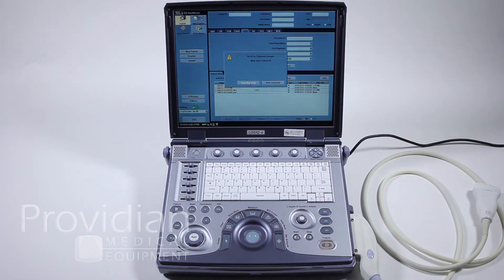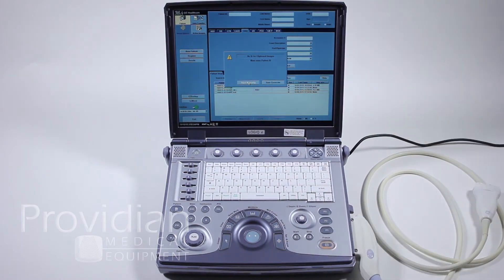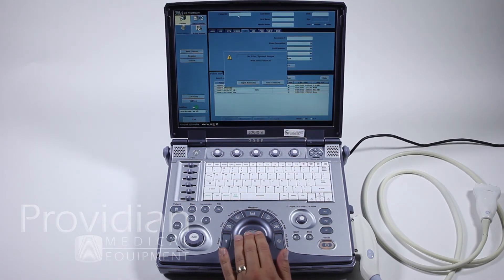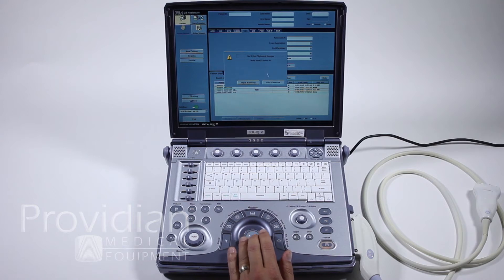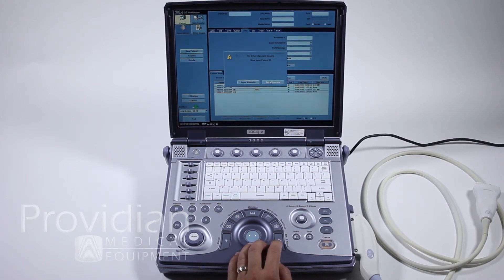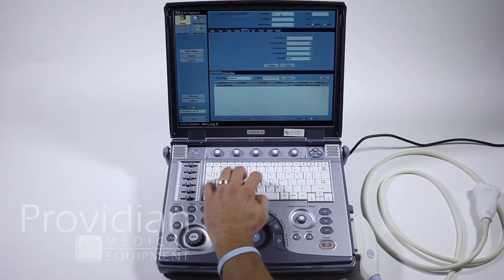It's important to have a patient ID because it ensures every patient has a unique ID. Down here you can see previous patients and reselect them in the future, so once you create a patient you only have to create them once. We're going to click auto generate for the patient ID. Your machine may have automatically generated a patient ID for you — this one I've turned off to show you how to have it auto generate. It's a good idea because it guarantees a unique patient ID for each patient. Now we have the patient ID and we'll go ahead and enter a new patient.